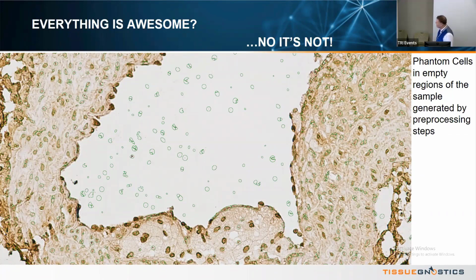The next thing we found was that we missed something. The training of this algorithm was done on a data set of H&E stained samples from multiple tissues acquired in multiple magnifications, so that it finds not only cells acquired with 20x, but also with 10x or 40x. But what we missed, and what the algorithm never learned, is that there can be a part in the image which is empty.